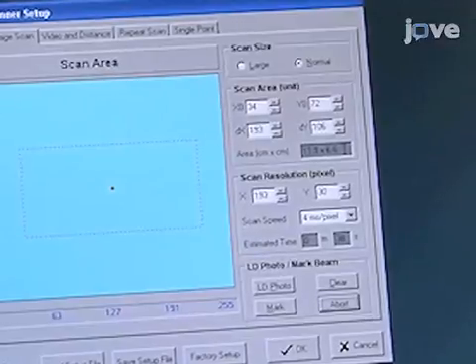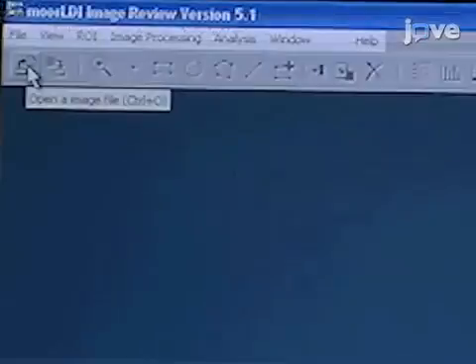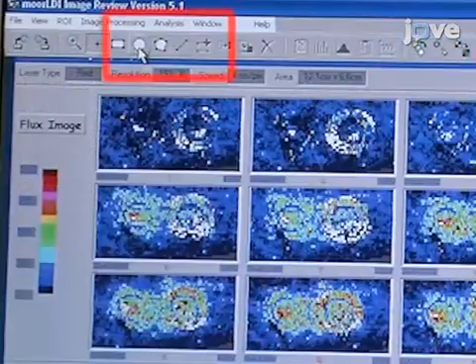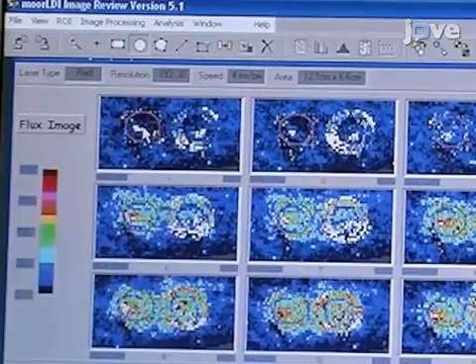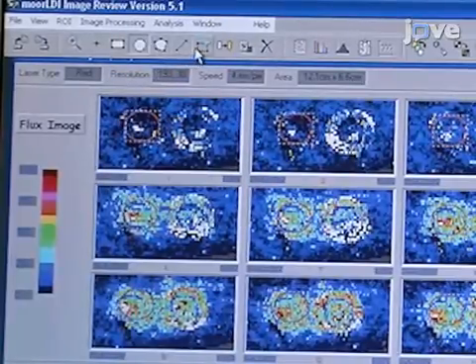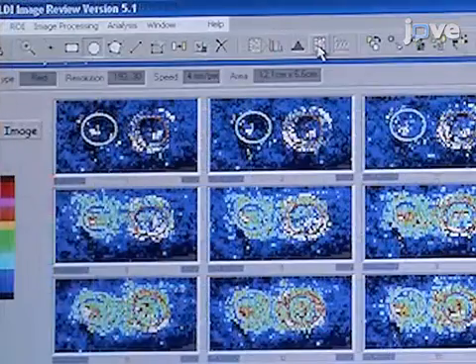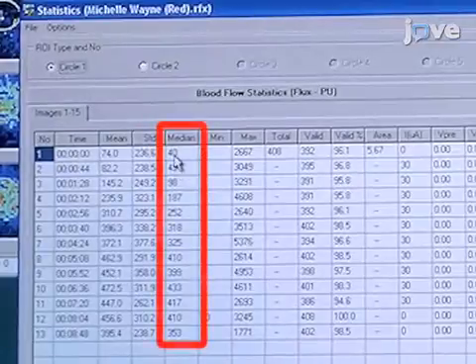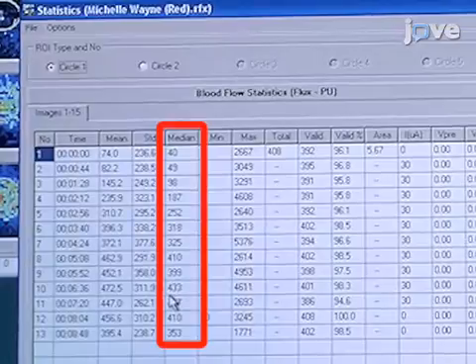The scan can now be started. Following completion of the scan, use LDI image analysis software to open the data file. Select the Image Review option in the main window. Now mark out a region of interest around the outer diameters of each chamber. Then click the Statistics icon and a column containing the median perfusion units for each chamber will be displayed. From each of the 12 scans of each chamber, take note of the baseline perfusion unit and the highest perfusion unit.